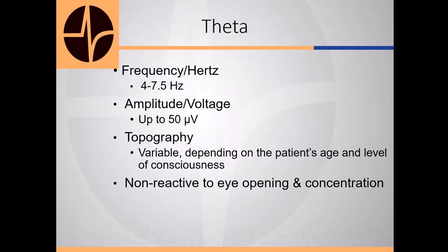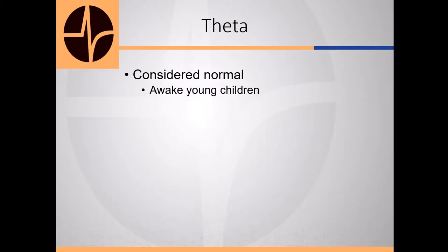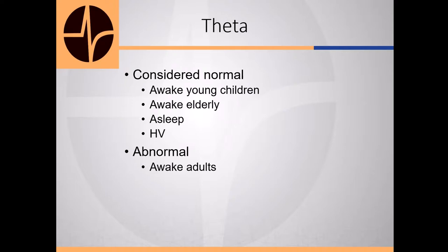It is non-reactive to eye opening and to concentration. It's considered normal in awake young children, awake elderly, and we have the definition is generally 60 years or older, and asleep, and during hyperventilation. It's abnormal in awake adults.